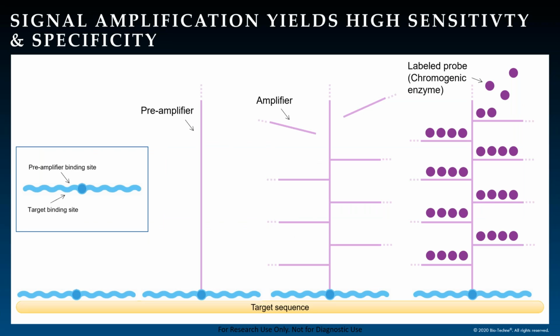One of the key features of the miRNAscope assay is the probe design. The oligonucleotide-specific probe is designed using an informatics algorithm that selects sequences to specifically bind to the target sequence and not cross-hybridize with any other sequence. The bottom of the probe design complements and hybridizes to the target transcript, whereas the top of the probe is the base for the amplification structure upon which a preamplifier can bind, and the amplification tree can then be built.